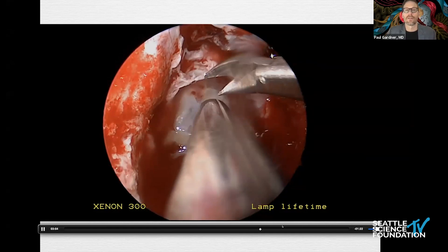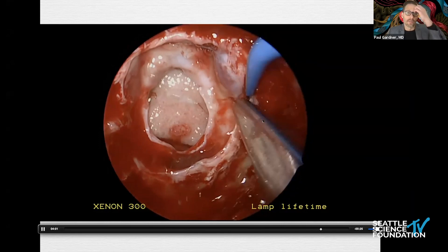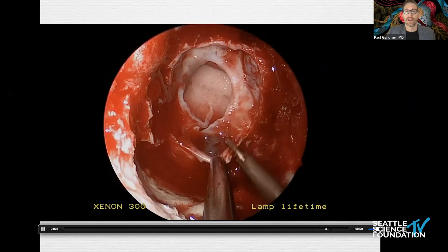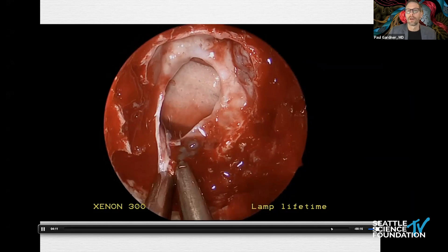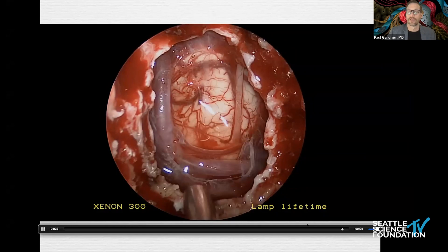This is a young woman — I want a radical resection, a complete resection of all involved dura. I'm stimulating the sixth nerve. You can see some tumor residual along the edges of the dura, so we'll go ahead and resect all of that. There's a little tumor in that interdural space — that's where it loves to grow. Dorello's canal is an interdural structure. Here's our final removal of all the periosteal and meningeal dura, right up to Dorello's canal, for a truly radical resection.